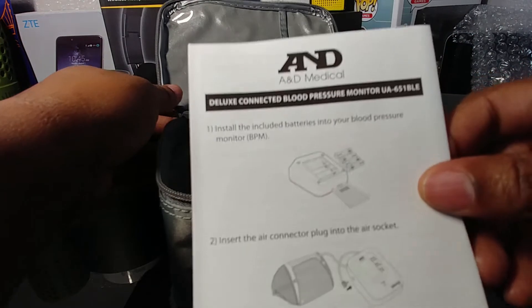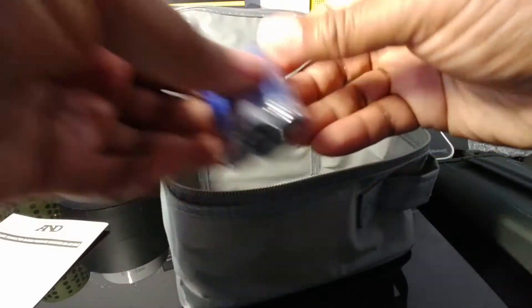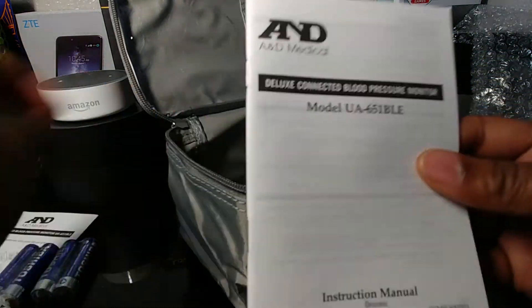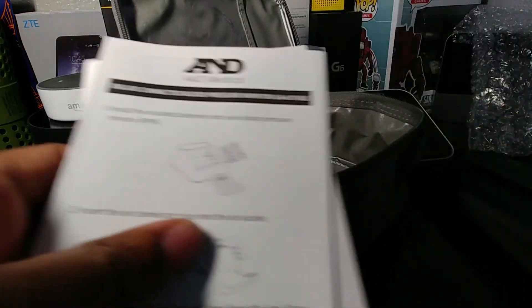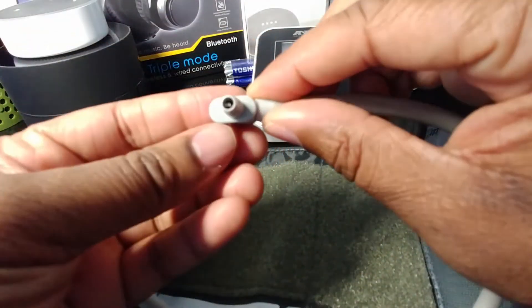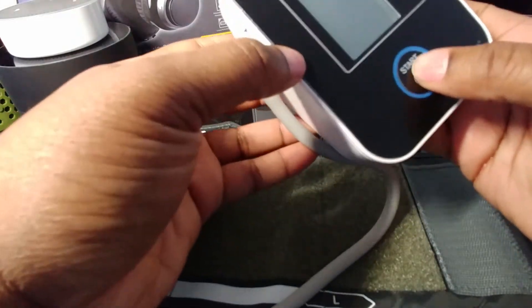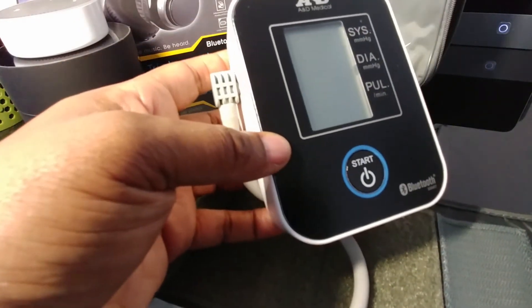There's an instruction manual, and what do you know — there are four double-A batteries included in the bag. This is the instruction manual, and this is a quick start guide. Looking at the arm cuff, you have your cable and that cable plugs directly into the unit — nice tight fit.